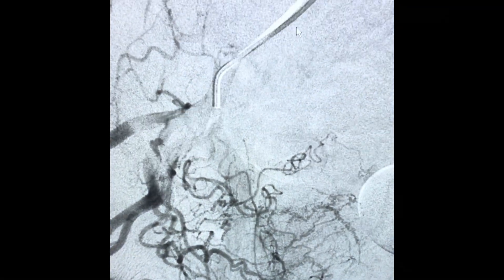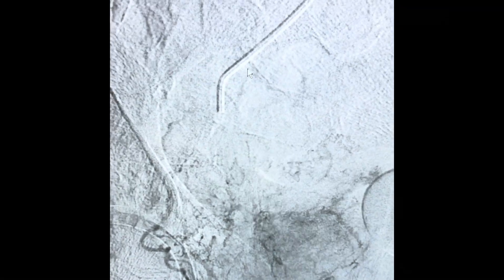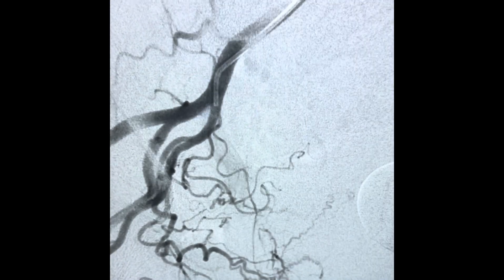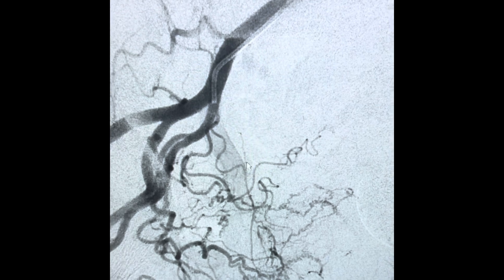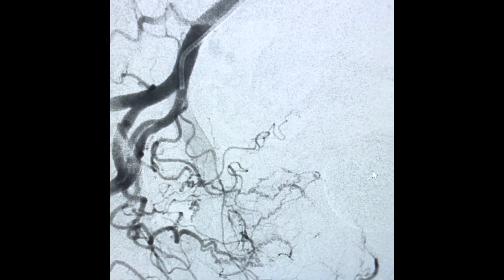After getting access into the radial artery, we're getting a catheter down into the internal iliac vessels. As you can see, we've placed a catheter in the internal iliac artery here, and this helps us identify the prostatic artery.